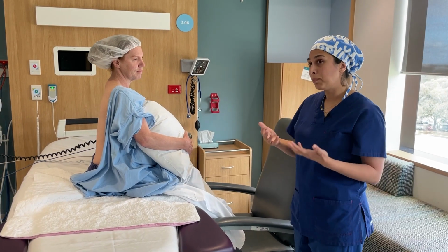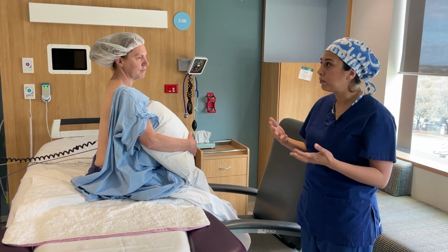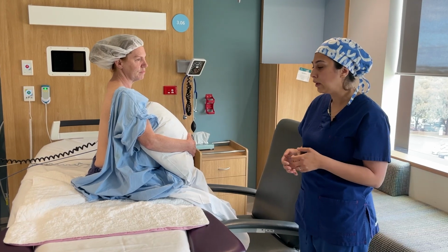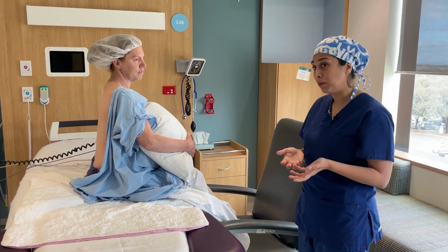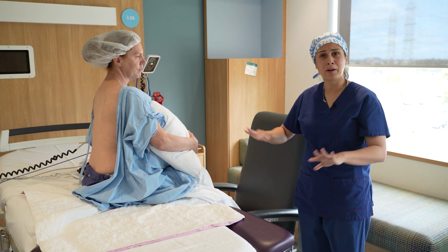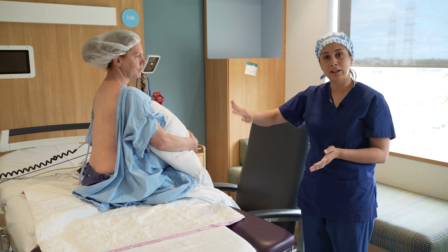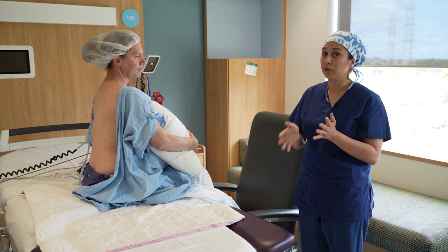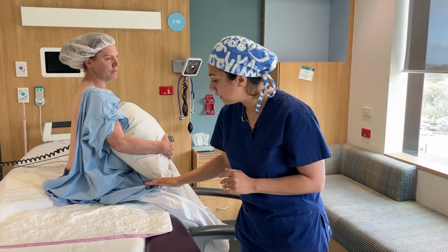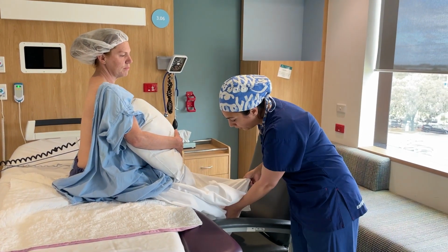In order to position the patient well for the actual procedure, often it's really important to help the midwife with that aspect so that you maximize your chance of first pass success. What I like to do that seems to be quite effective is get the patient to sit on the bed and make sure they're not sitting on a part where there's a bit of a gap or a crack in the bed itself, because that can lead to a bit of a slump and difficulty in finding your midline and your center point.